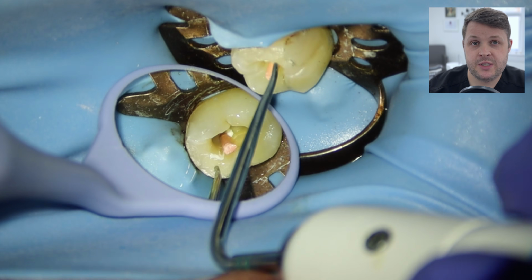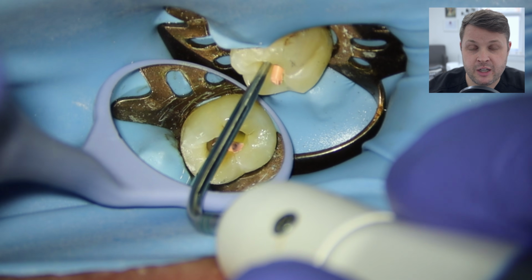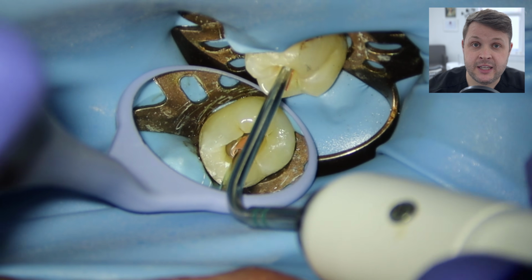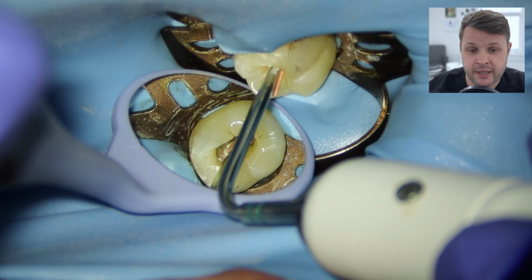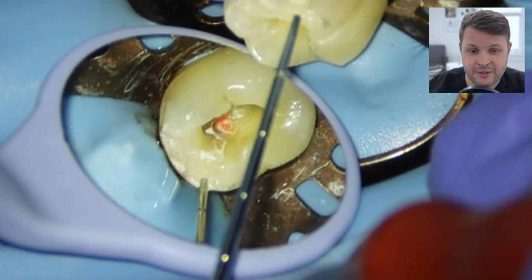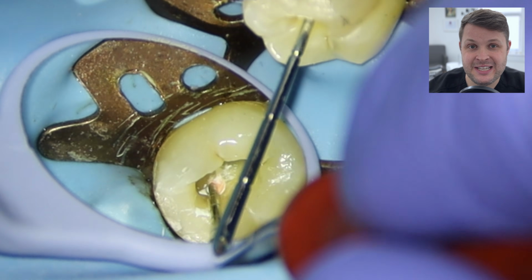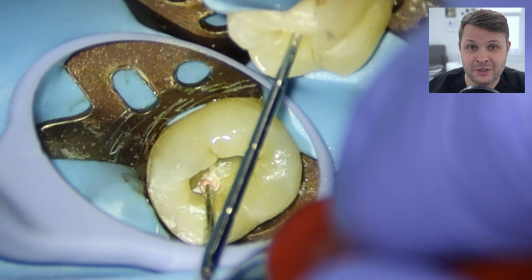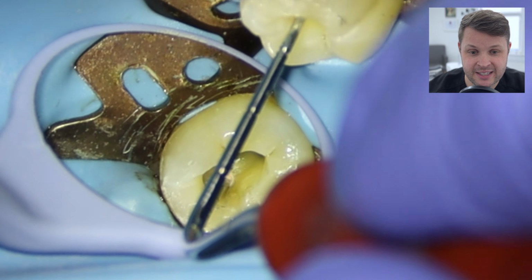Obviously I'm not going to use this heated plugger far down into the canal space, and once we've removed the excess, I'm going to use a Mach 2 plugger just to condense this GP cone down nicely to length. And you can see here that the mesiobuccal and the mesiolingual are confluent because you can see the sealer in the two canals.